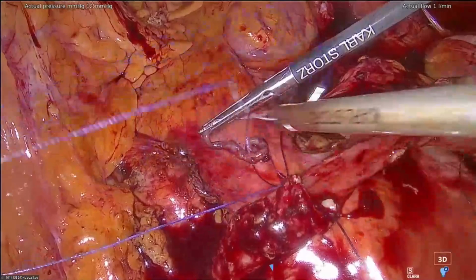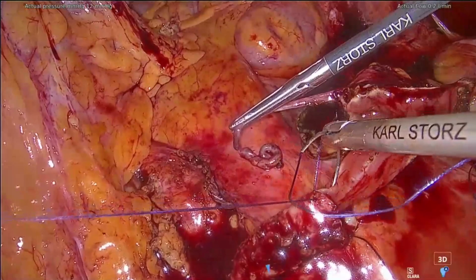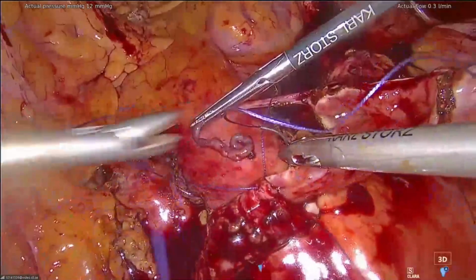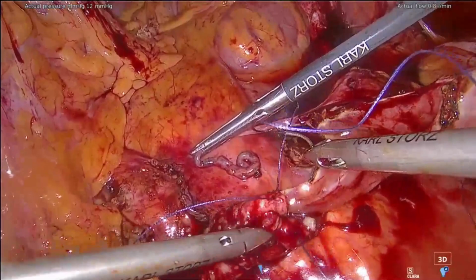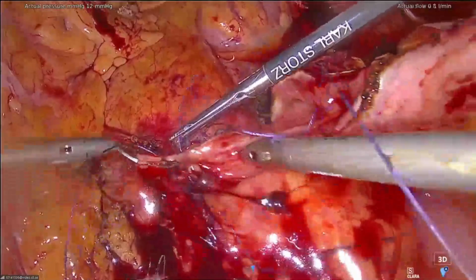Because the other side works very well. The right ureter is in the retroperitoneum, also mobilized, with a lot of fibrotic tissue around. The right side works perfectly well, and we put it in danger if you have a complication later. For me, it's the major issue when we do a ureteroureterostomy. That's why I think that finally, if it works, I hope that it will work, it's a good compromise.